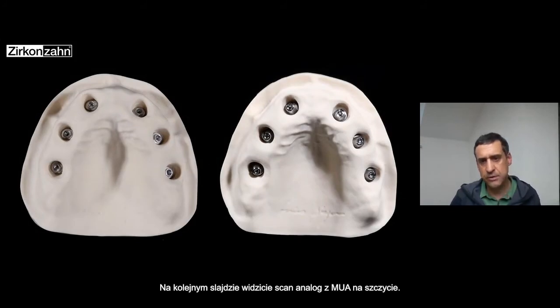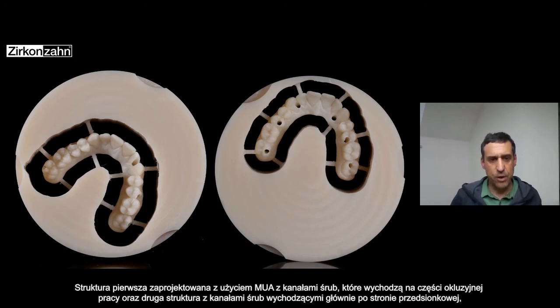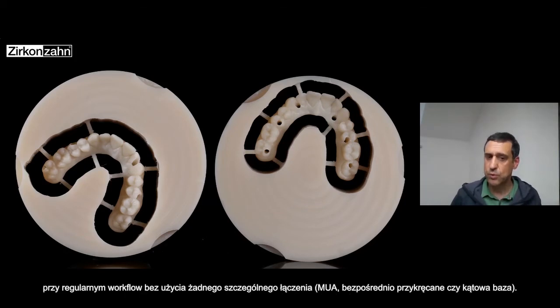You can see the scan analogs with the multi-unit abutment on top. Then the milled framework — the one with a multi-unit abutment with the channel screw coming out occlusally — and with the channel screw coming out from the vestibular side, which was the regular one connected directly on the implants without any particular connection.